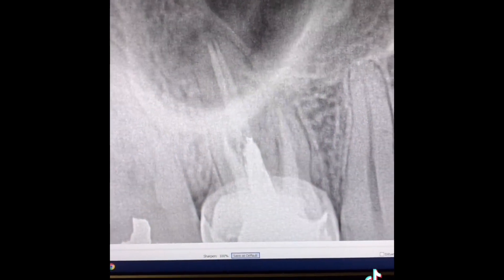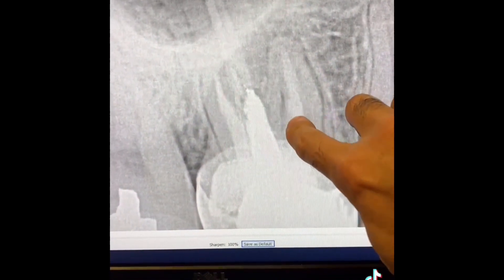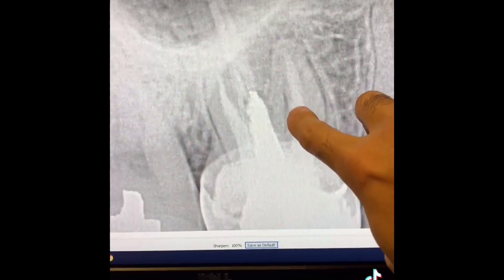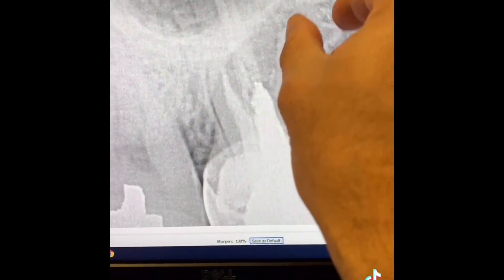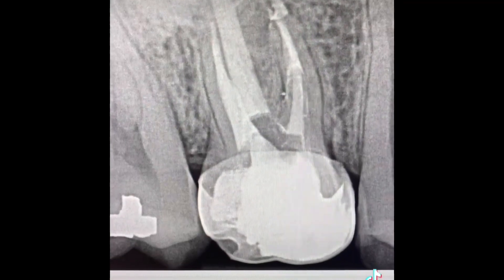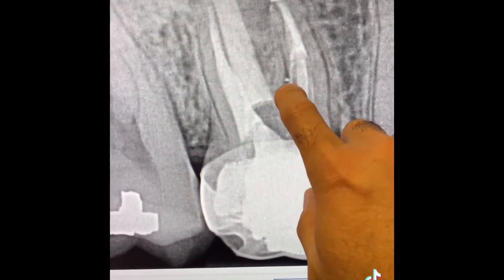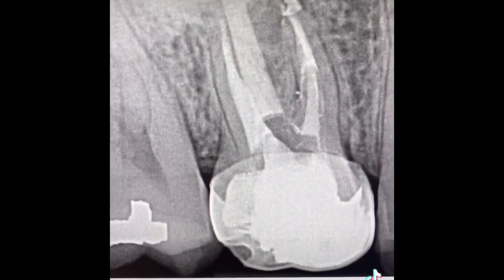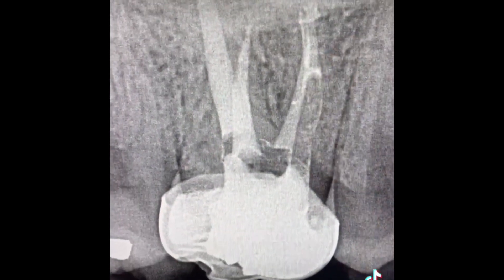We removed the gutta-percha. Take a look here — you see this widened periodontal ligament in this area? Well, that was a strip perforation. As you can see, the MB canal was over-prepped. This is the post-op. I repaired the perforation with MTA here, and of course there was also a missed MB2.